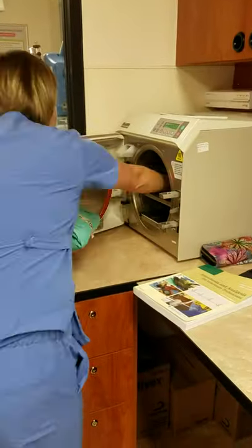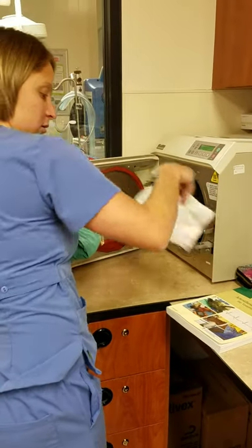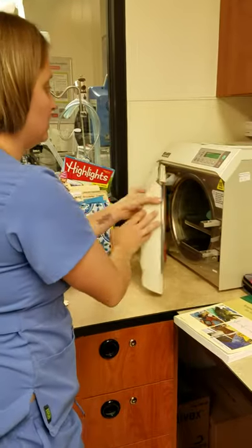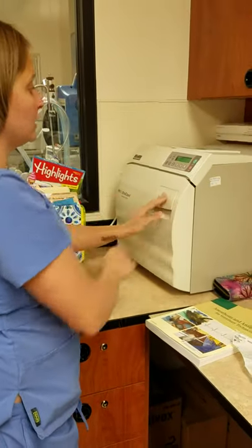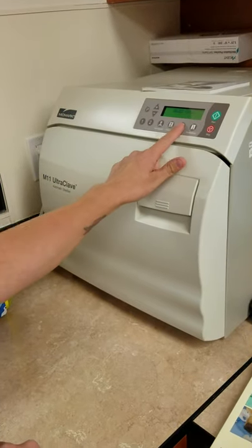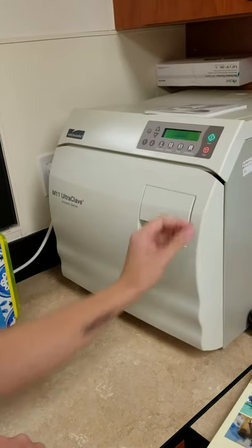I'm going to put it in and make sure it's not touching the sides or anything like that. Make sure the door is fully tight. I'm just going to hit 'packs,' start — good to go.